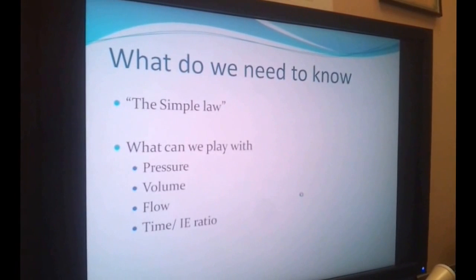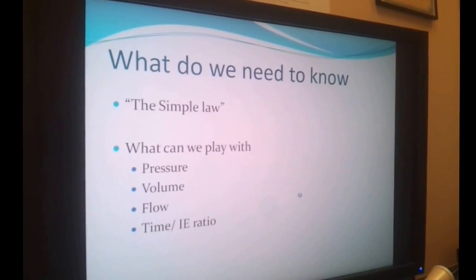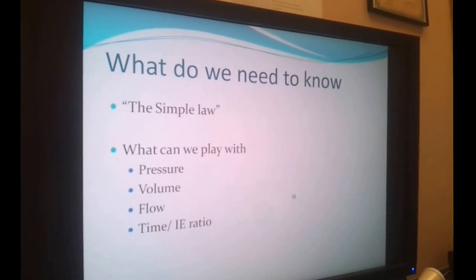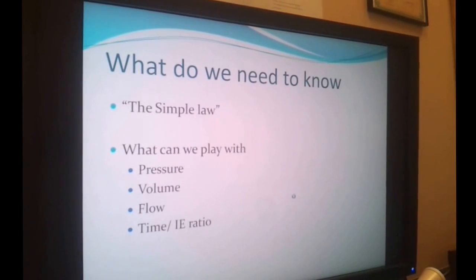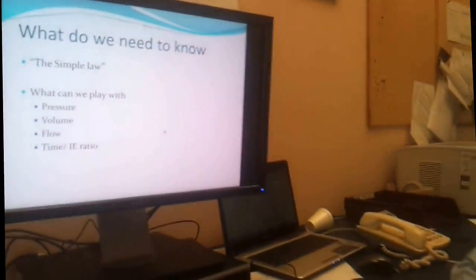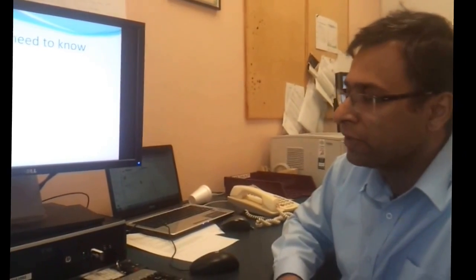What we can play with to let people exhale is the pressure, the volume, the flow, and the time we allow the air to go in and the time we allow the air to come out, which is called the IE ratio, inspiratory to expiratory ratio.